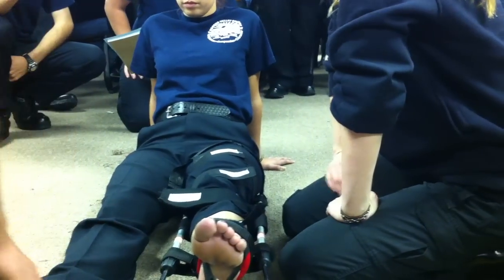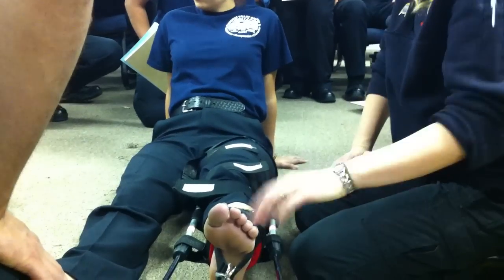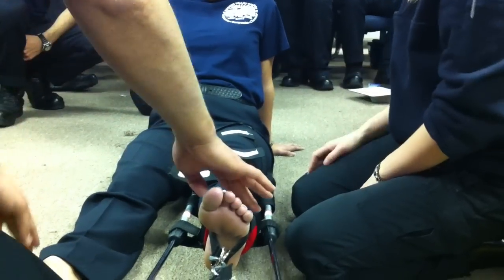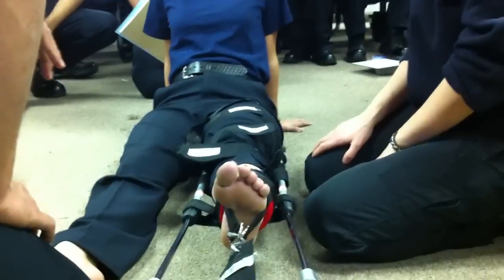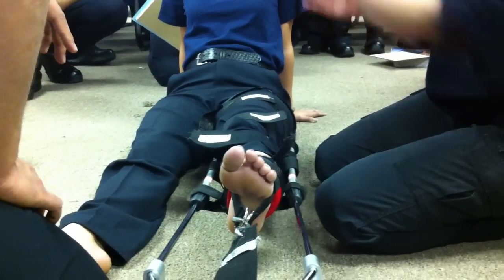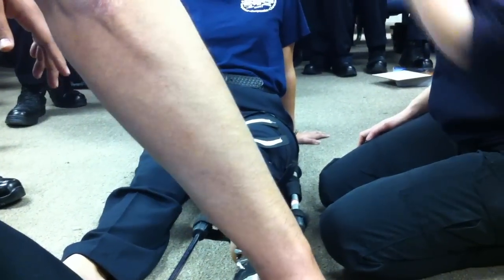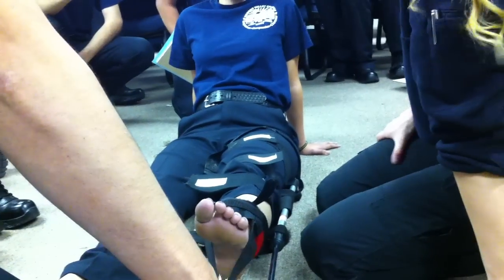Recheck circulation, motor function, and sensation in the extremities. You're going to compare your right to your left. See if there's any relief in pain. Check your pulse, motor, and sensory. Make sure there is relief in pain, or that you've controlled the bleeding or anything else like that. Nothing's sticking out all funny anymore. Is there anything else? Alright, so that's good, right?